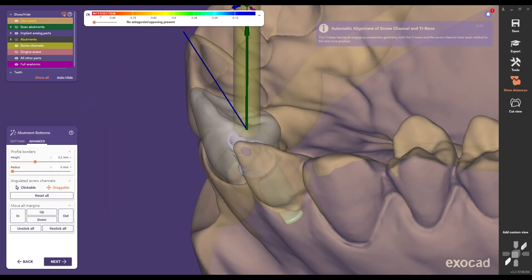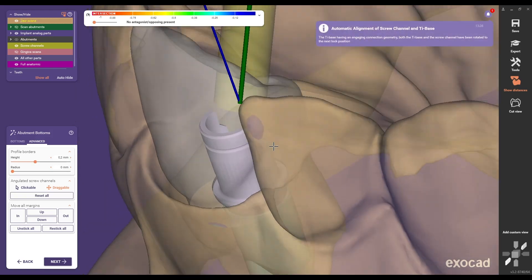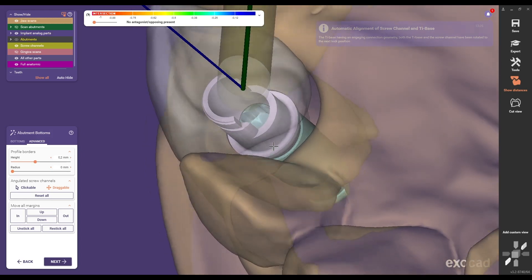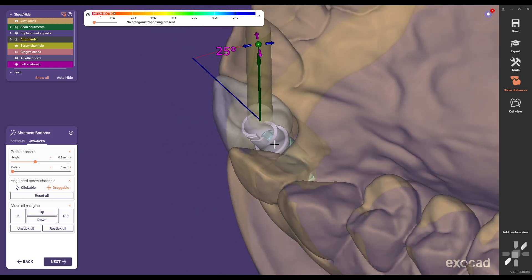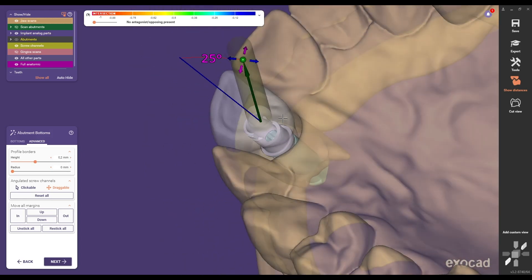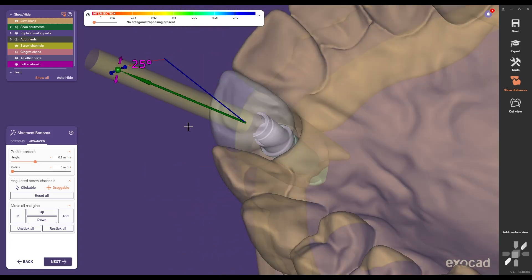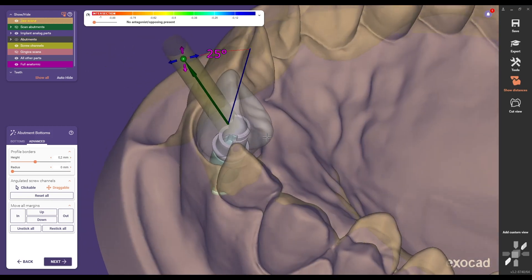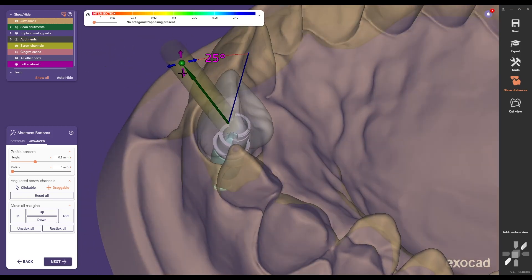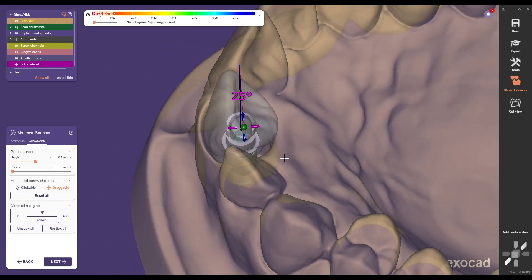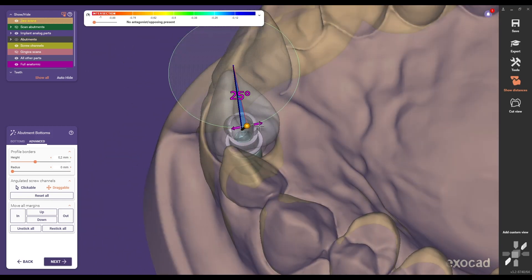The titanium base rotates depending on the prosthetic interface. In this case there are four possible positions. For hexagonal compatibilities there are six positions and for three point connections there are three.